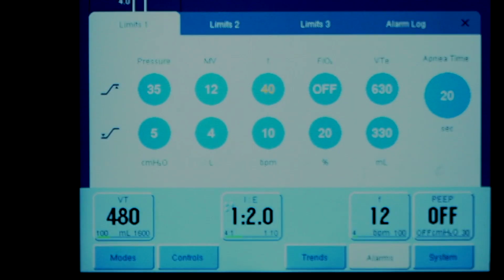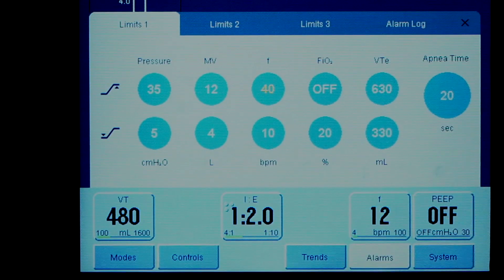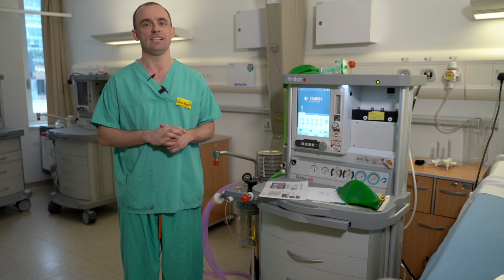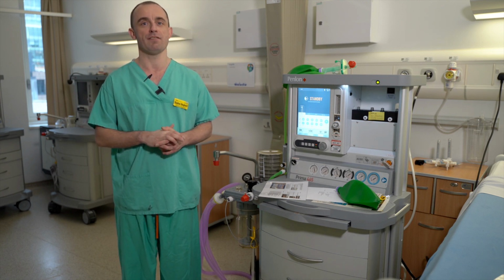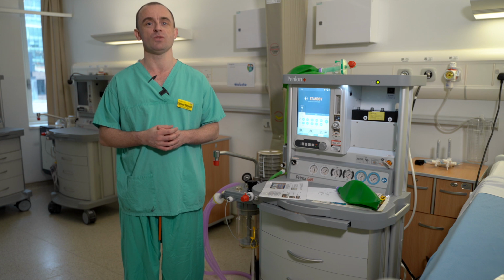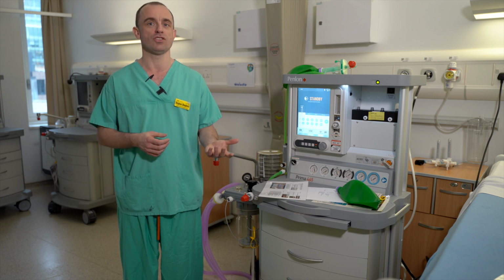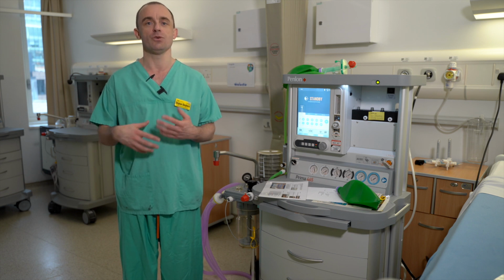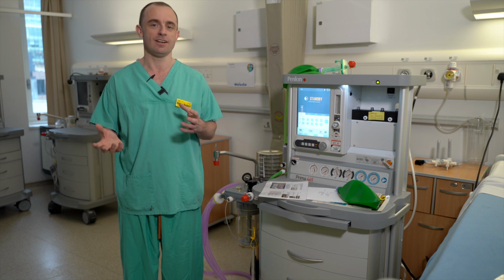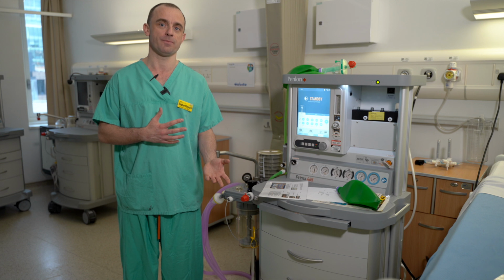Next, we have the FiO2. Now, this brings us to one of the most fundamental differences between an anaesthetic machine and an ICU ventilator. In an ICU ventilator, you set the FiO2, or fraction of inspired oxygen, that you want the patient to have. But in an anaesthetic machine, you set a blend of oxygen and usually air in order to generate a gas flow. And the relative proportions that you set give you what your FiO2 is.